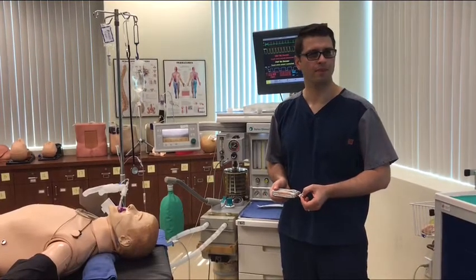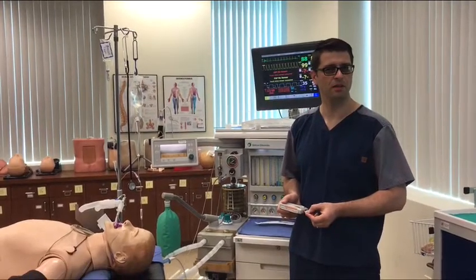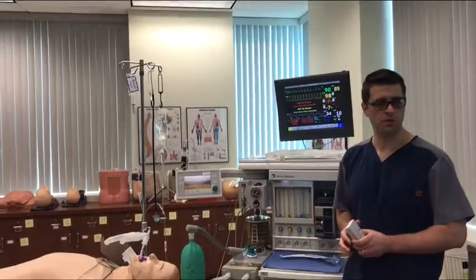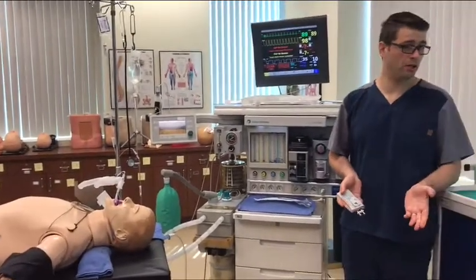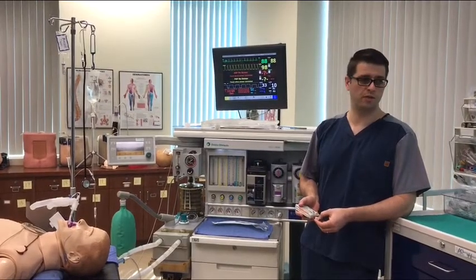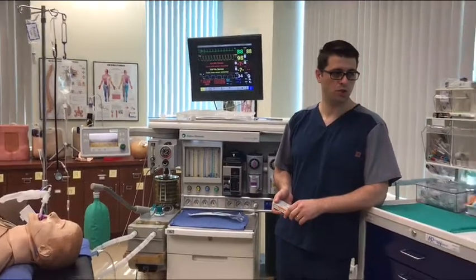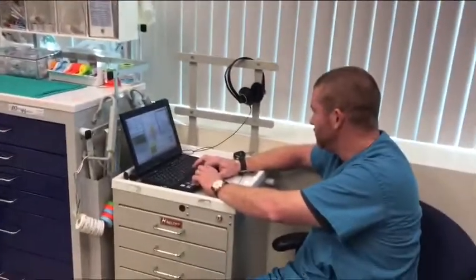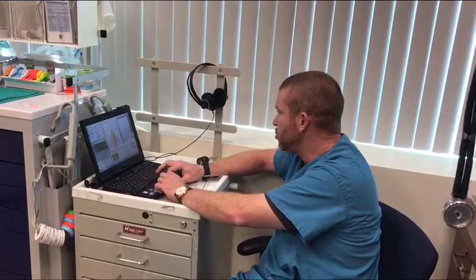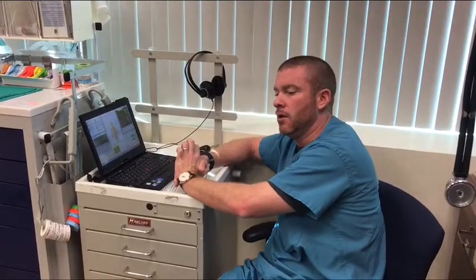Not all at once, please. Tell me some things you're thinking about. You're looking for signs of the patient waking up. I want to see maybe a curare notch. Spontaneous ventilation, trying to breathe on his own. So let me make this a little more real. Change my settings to maybe pressure support if I see that. So you're on the right track. You're looking for a spontaneously ventilating patient.